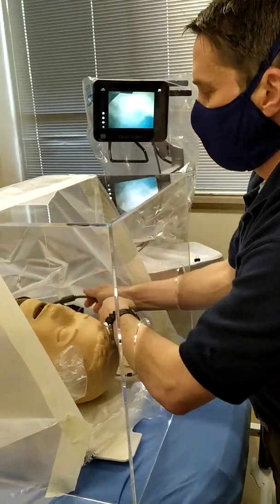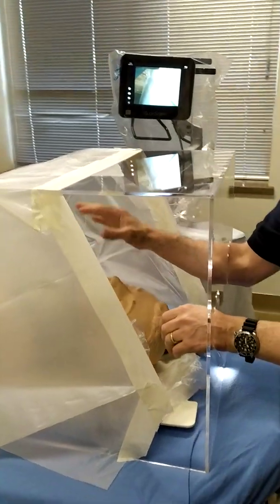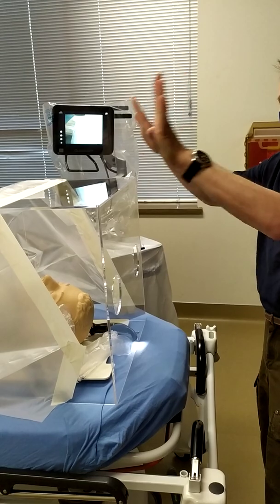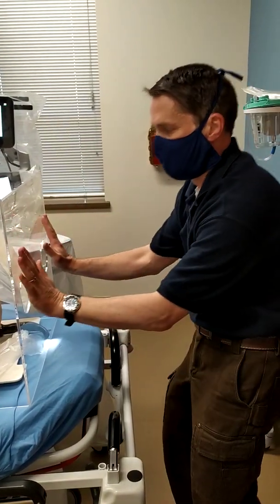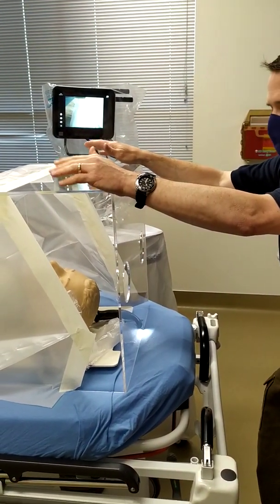From there, your RT is able to reach under. Once you've got the ET tube in place, you're able to connect the ventilator and start taking care of your patient. The benefit of this is it's protected our entire room from a lot of vaporization.